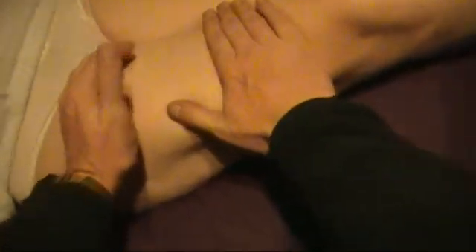For this example, we're going to assume that the patient has an arterial bleed from just above the knee area. Now, the tourniquet, you don't want to place directly over the wound site. So if the wound was like here, you'd actually want to place it above it, a hand's width just above it.